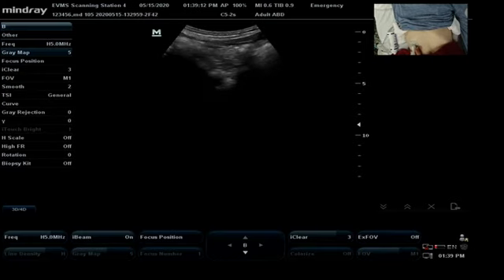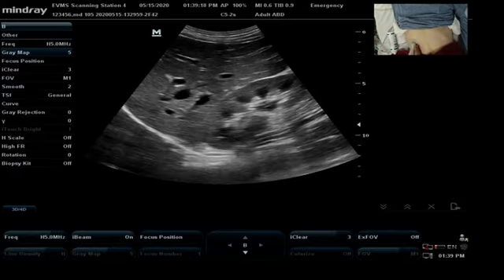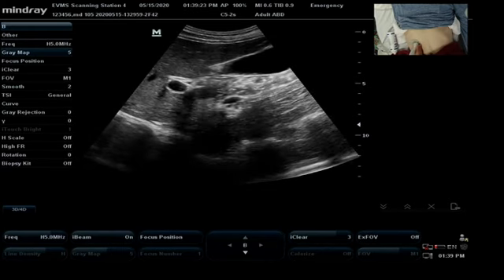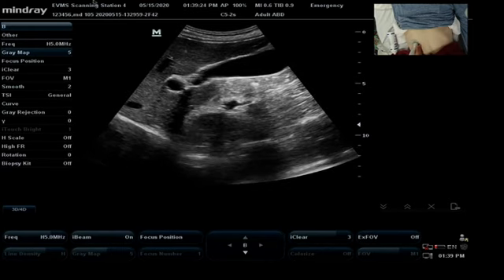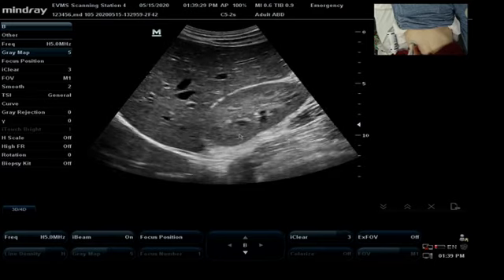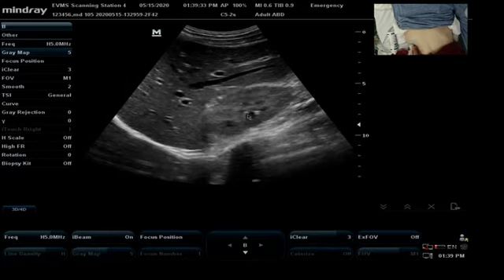I'm going to survey his right kidney first. Take that in. Hold it. And by doing that, I'm going to move medial until the kidney's gone. There's some gallbladder right here. And then I'm going to move lateral until the kidney's gone and see any masses. Breathe.